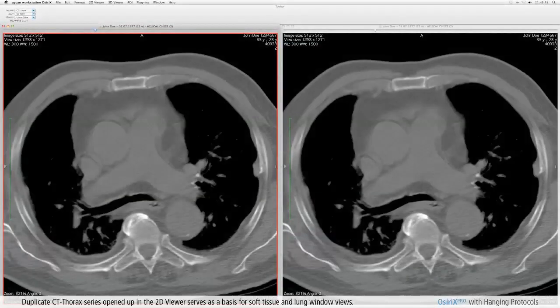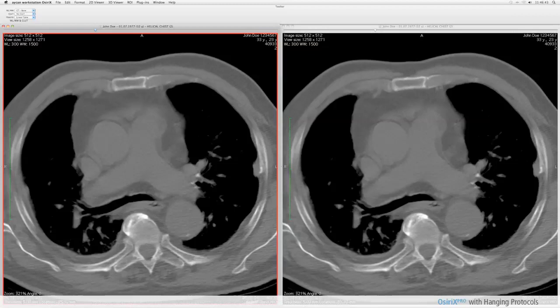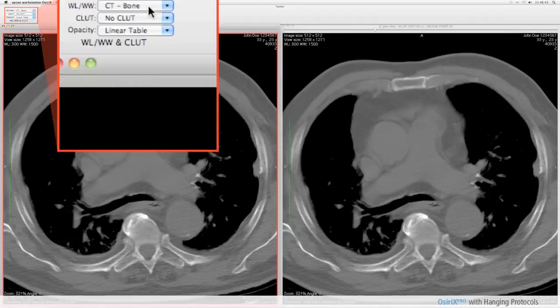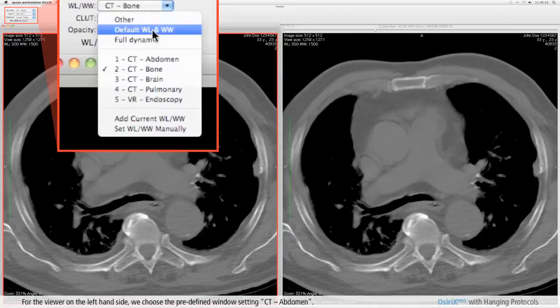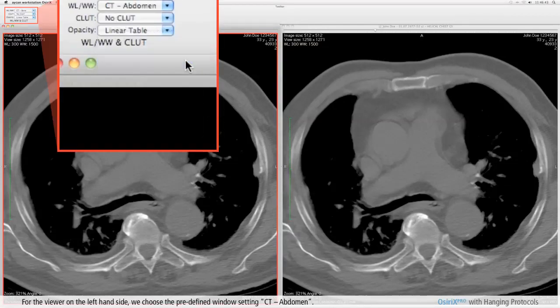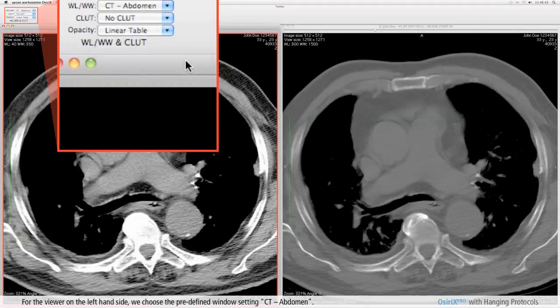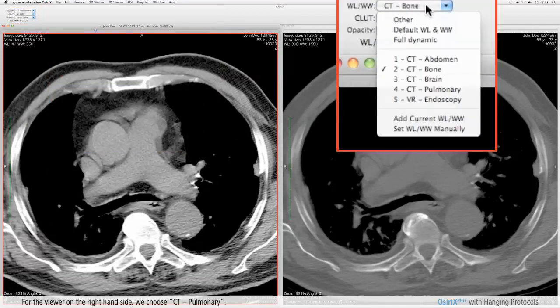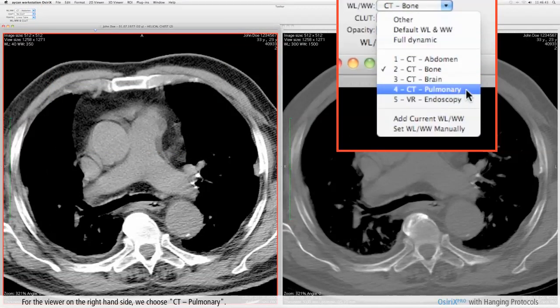A duplicate CT Thorax series opened up in the 2D viewer serves as a basis for soft tissue and lung window views. For the viewer on the left hand side we choose the predefined window setting CT Abdomen. For the viewer on the right hand side we choose CT Pulmonary.